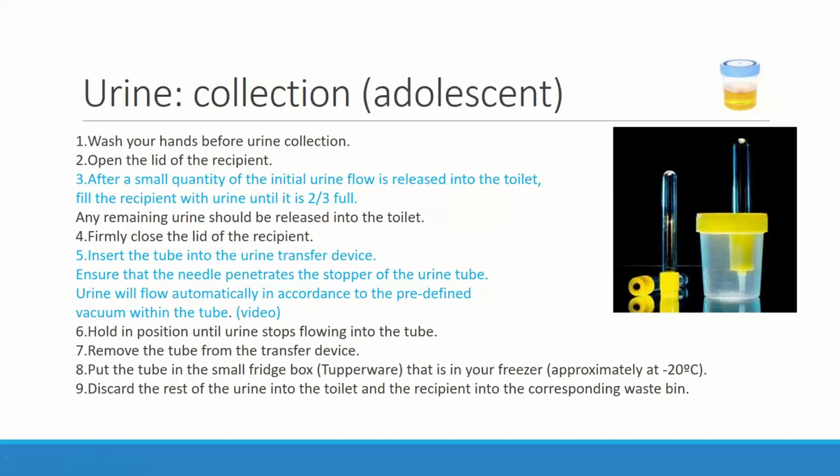These ones are going to be bought centrally at ES Global. Okay, and I think we double checked with the lab, and they are made of PP, polypropylene. I think that it's one of the less problematic plastics. Yeah, polypropylene works very fine, but in some of the Vacutainer tubes, they always add some kind of additive like boric acid or... They do not have any additive. No, perfect. Okay. No, we double checked it.